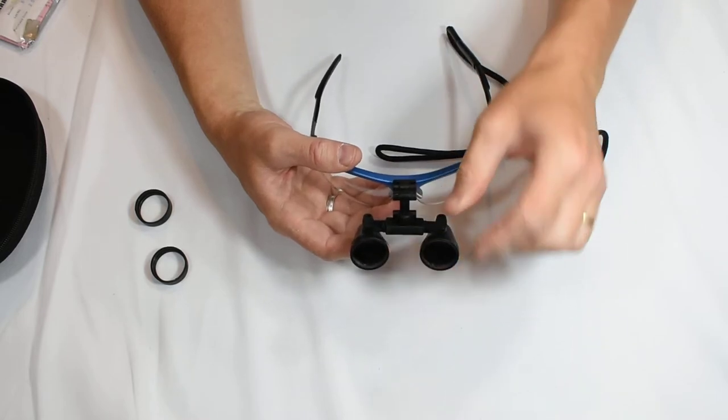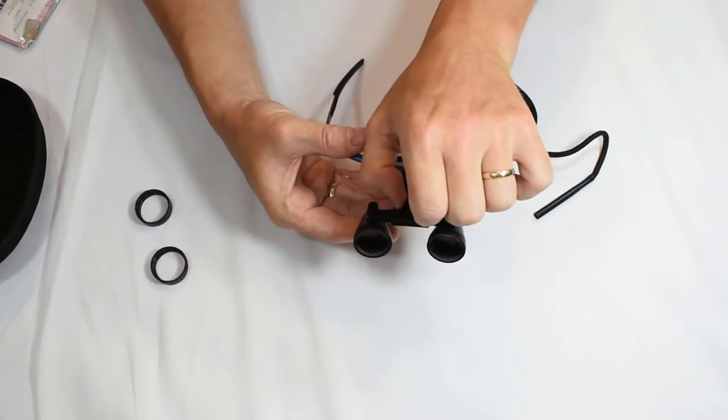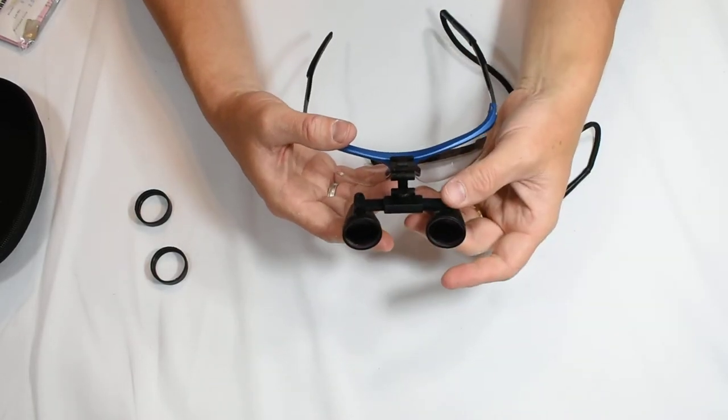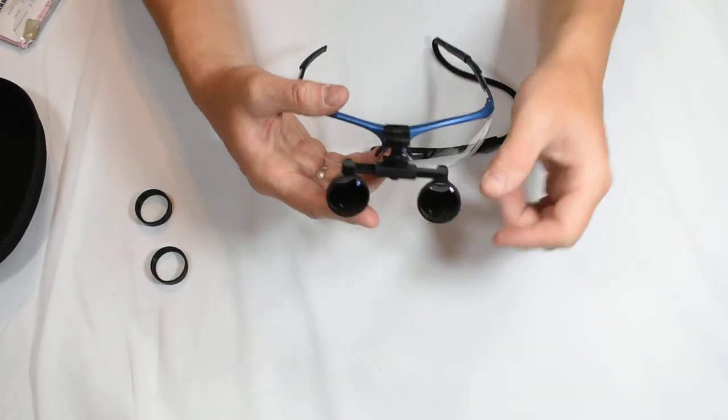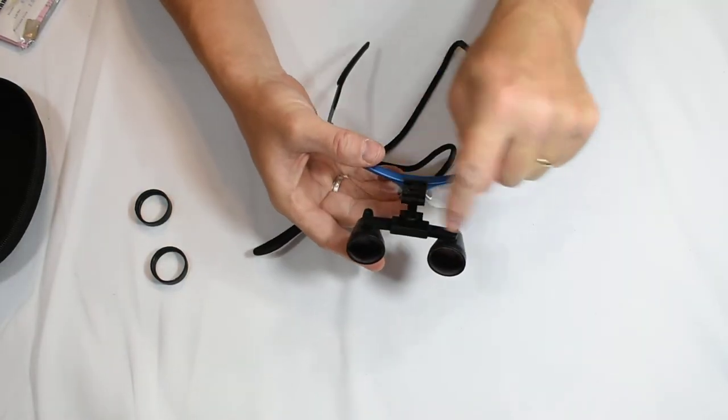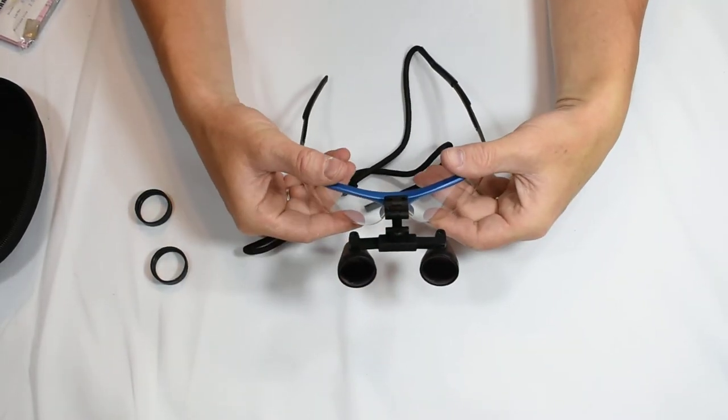So what I need to do is turn this knob left or right to make that adjustment, and then once it's set then I can just tighten the screw underneath and that will hold that into that position.